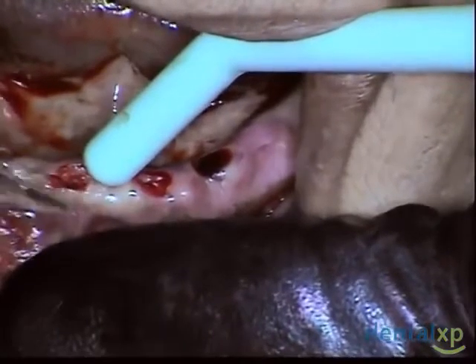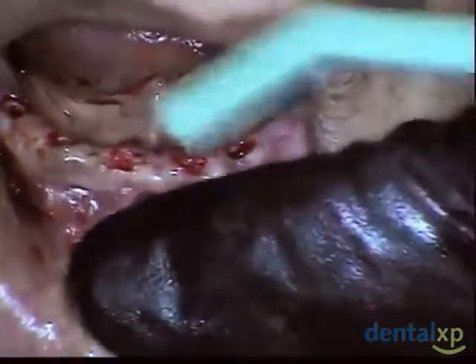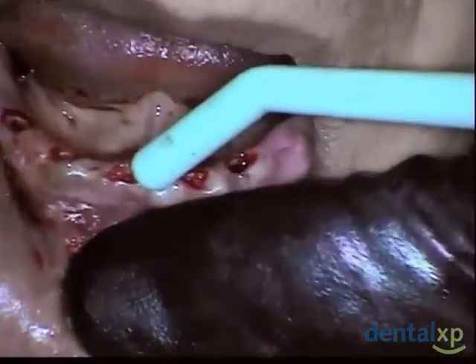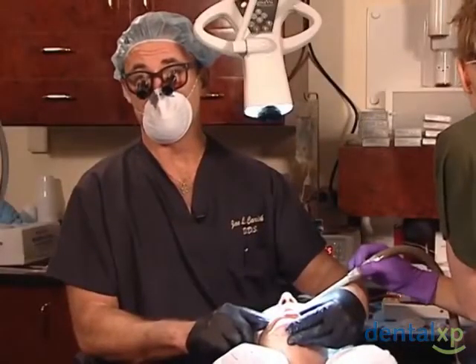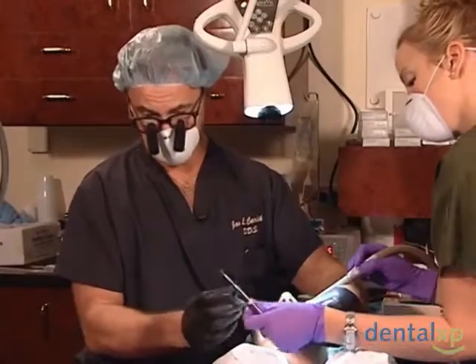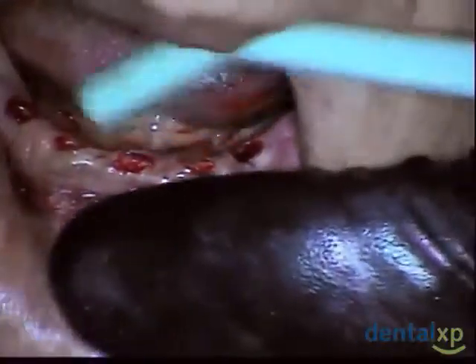And I don't have a problem going beyond the mucogingival junction, but if you don't have to, why? So now I'll get my tissue punch. The one I'm using is a 4mm tissue punch, which will be a little bit broader than our 3.4 abutment. This is the tissue punch that we'll be using. And we'll have our patient open real big.